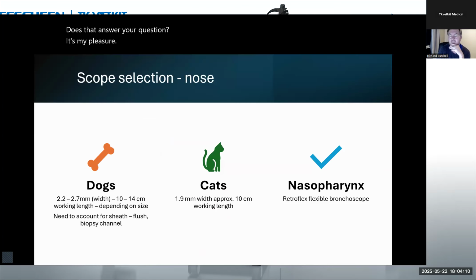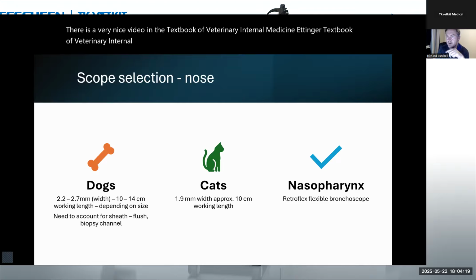There is a very nice video in the Ettinger Textbook of Veterinary Internal Medicine, in the current and the previous edition, that shows the access to those airways quite well.